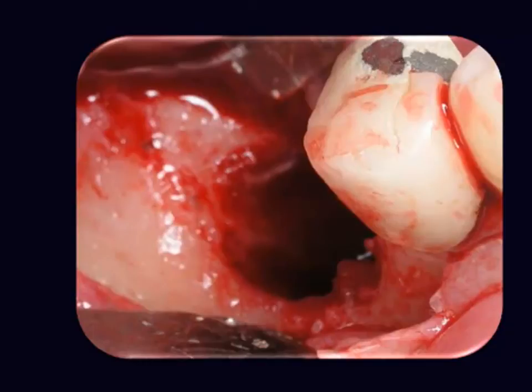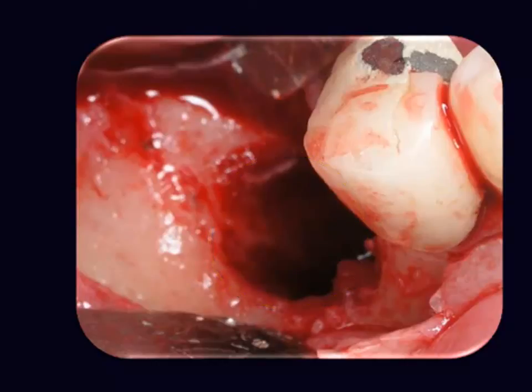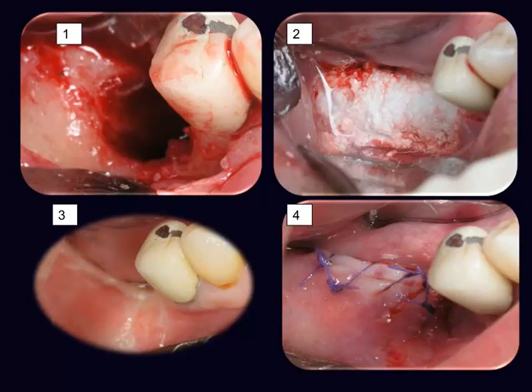Case 6 describes a defect formed post-implant failure. The defect is surrounded by 4 bony walls. This case is optimal for the indication of using BONDBOND by itself. 3 months post-BONDBOND augmentation, a complete bone regeneration is observed.